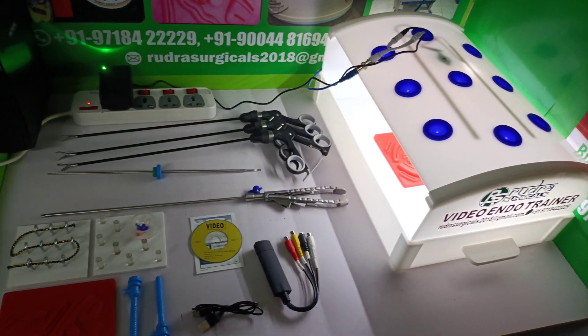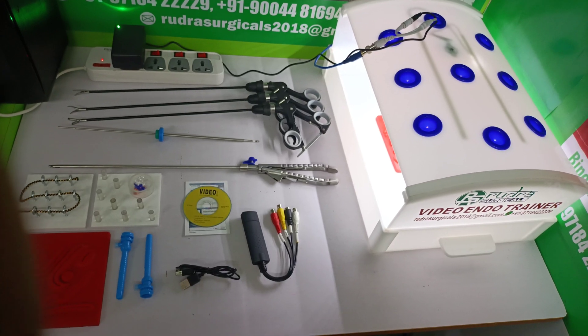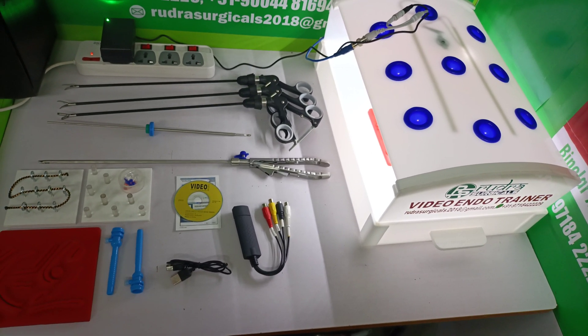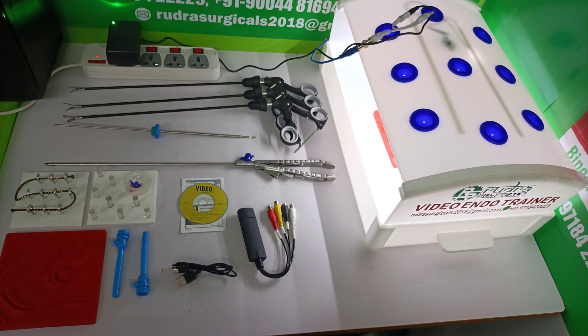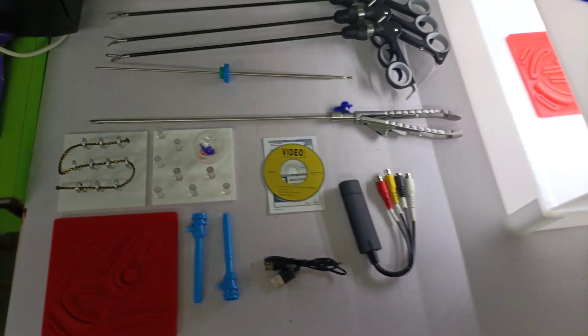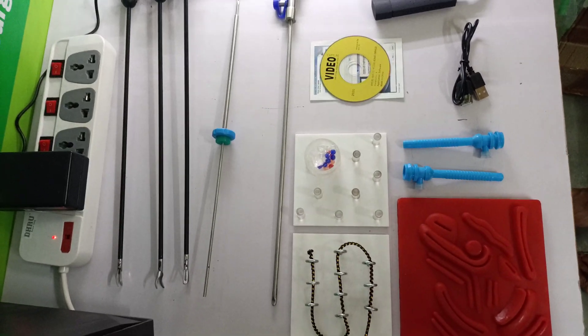This is a rectangular shape trainer along with five instruments: one is curved scissor, Maryland, fenestrated, one knot pusher, and needle holder. All these instruments are metal, industry sizes are 5mm, 330mm.